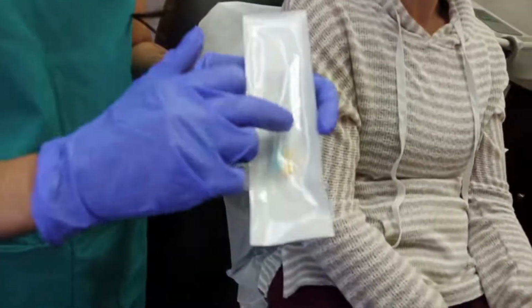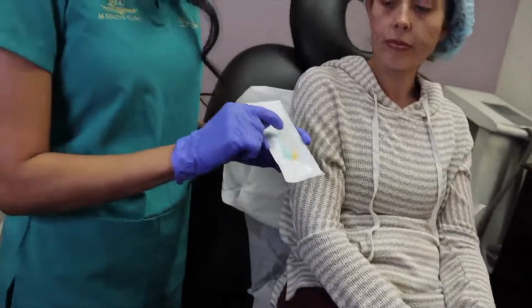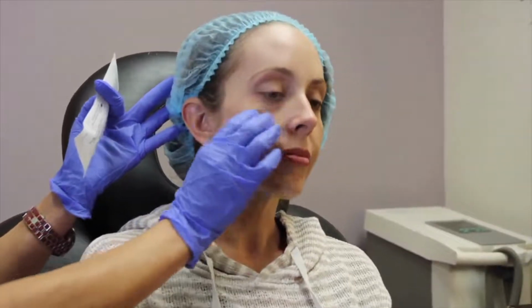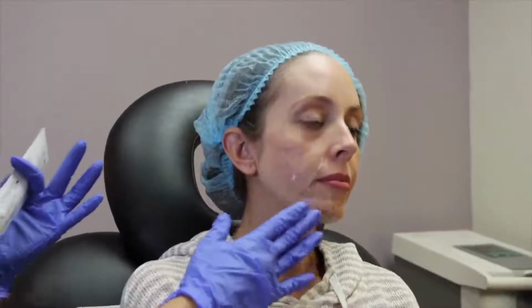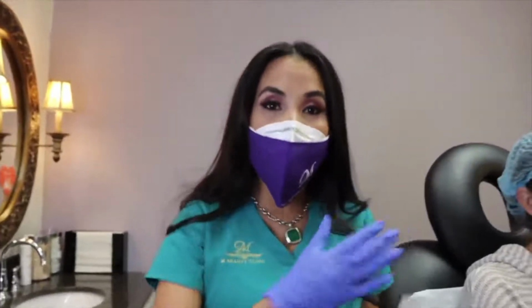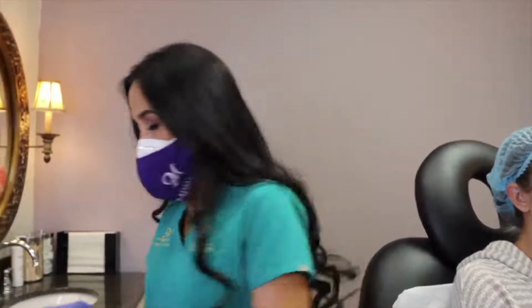A cannula will make a little tiny opening, and then this little tube here, the opening is all the way to the tip, but it allows me to enter through one area and then reach the entire cheek, essentially, from the sides to the mid cheek to around the mouth with one opening. And then I'll save the needle if there are small little areas that I really want to perfect. But this allows me to do a global volumization without having to poke the patients many, many times. So here we go.